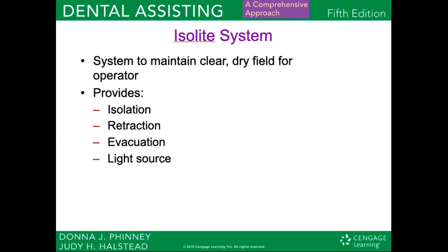So you can see a picture of one on figure 19-35 on page 428. And in that picture, it's kind of propped up in that patient's mouth. The cool thing about that also that I didn't mention before is it has a bite block kind of built into it. So not only does it help retract tissues, evacuate, and provide a light source, but it also is like a prop or something that the patient can rest on so that they can stay open without having to worry about it. So I think it's a really cool gadget to have.